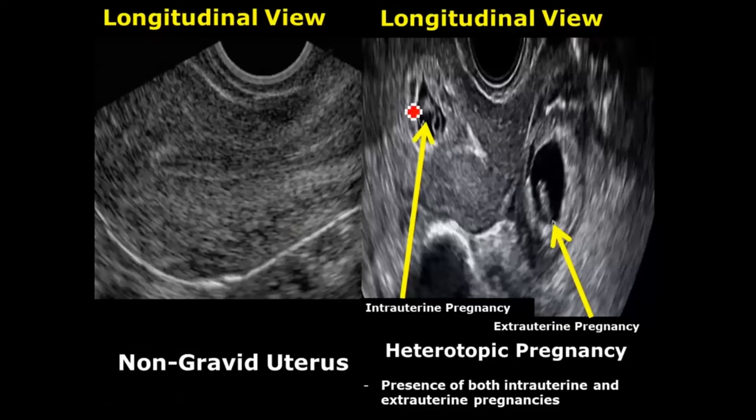Heterotopic pregnancy occurs when there is a presence of both intrauterine and extrauterine pregnancies. This gestational sac is in the normal location inside the uterine cavity, whereas this gestational sac is around the cervical region — an abnormal location.